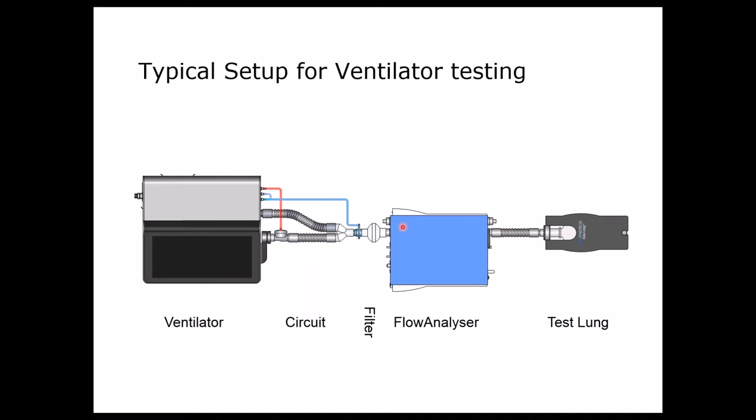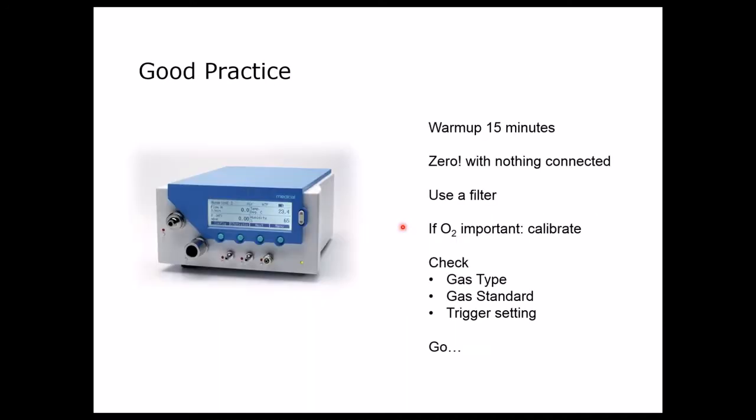Before we start, we have to do a couple of standard steps. We want to warm up the PF300 for 15 minutes. Also, ventilators should be warmed up for some period of time before you do any calibration or verification procedure.